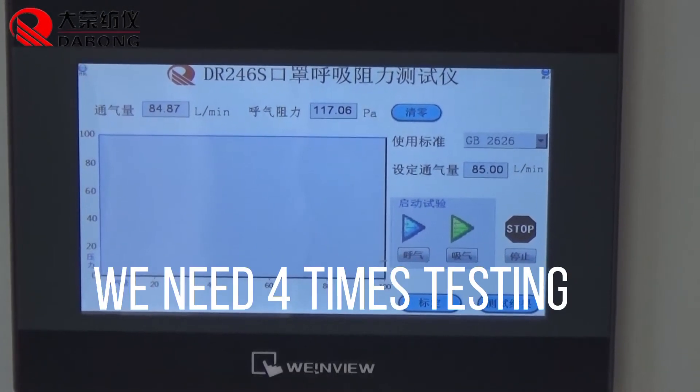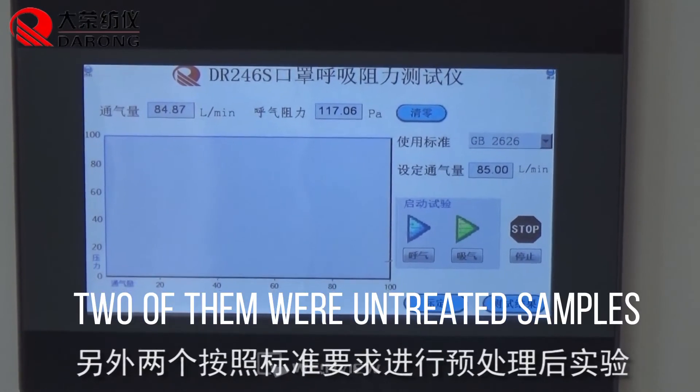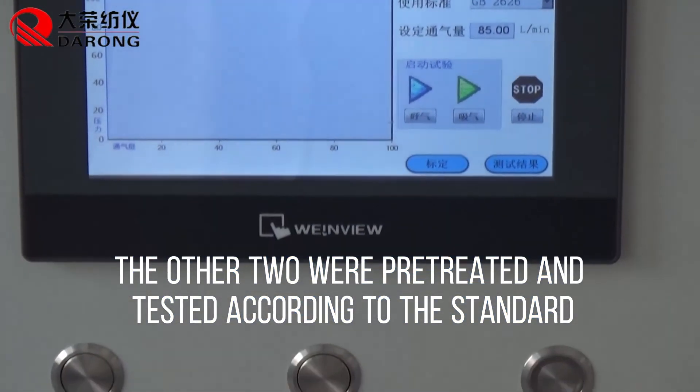We need four samples total for testing. Two of them are untreated samples, and the other two were pre-treated and tested according to the standard.